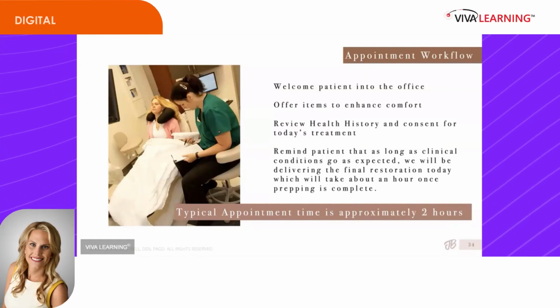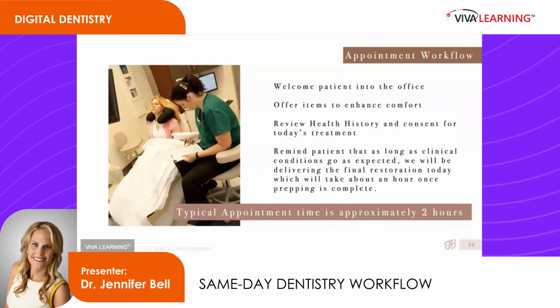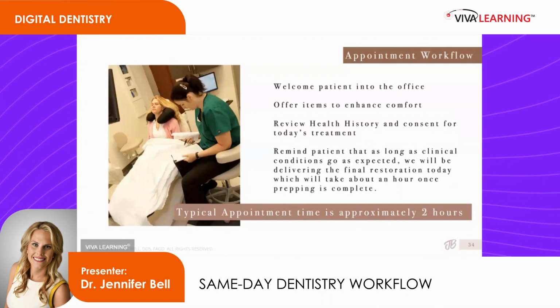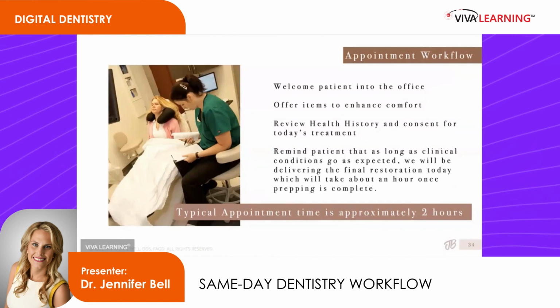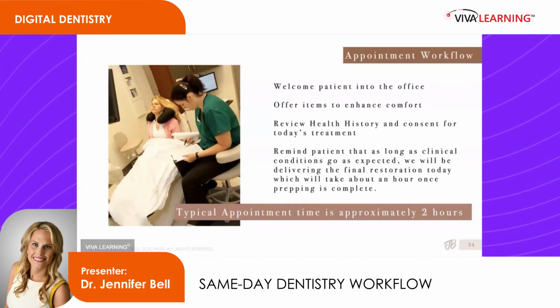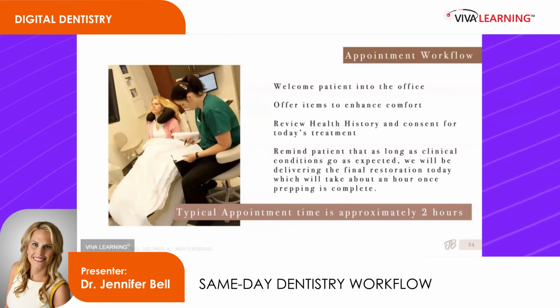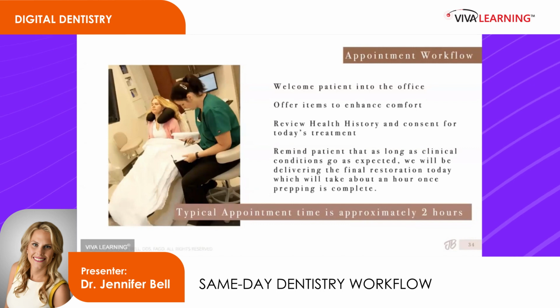We're going to start with welcoming the patient in. I have pre-booked the patient for somewhere between 1.5 to 2 hours, depending on the complexity of the crown that we're intending to prep that day. Update your health history, get your consent ready. My assistant's doing all of this while I'm either doing a hygiene check or maybe just frankly watching a funny YouTube video, so that I can come in and start moving forward with the procedure.